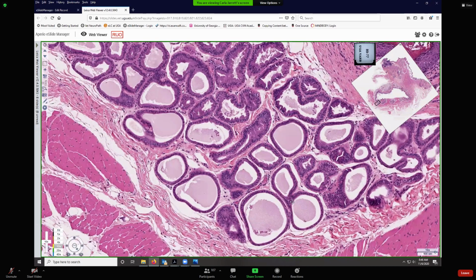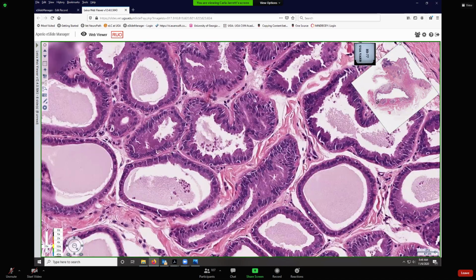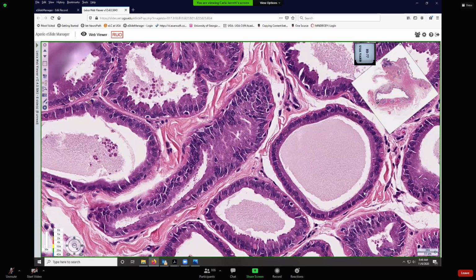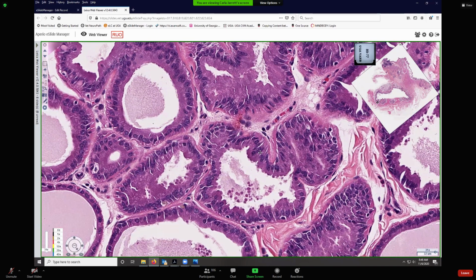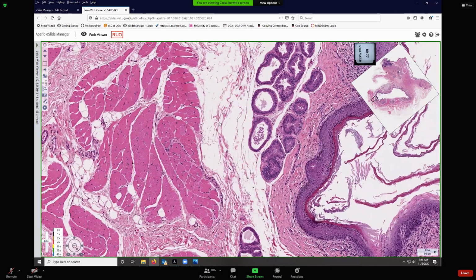If they are empty, then there's no pressure to cause inhibition of secretion. So like this one is filling up with secretory product. So we're getting pressure feedback and these cells are getting flattened out and they're slowing down production. But these guys don't have much of anything in their lumens, so they're maxing out production. So they'll be more of a tall columnar cell. Here you can see the little pinched off cytoplasmic packages. That's that apocrine secretion.